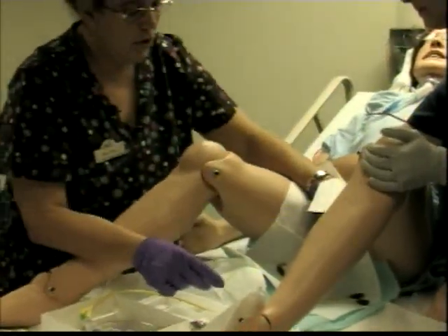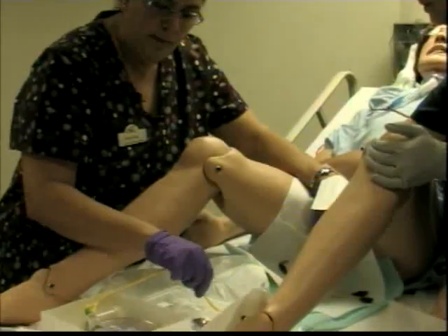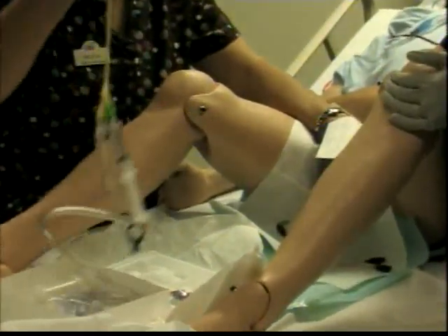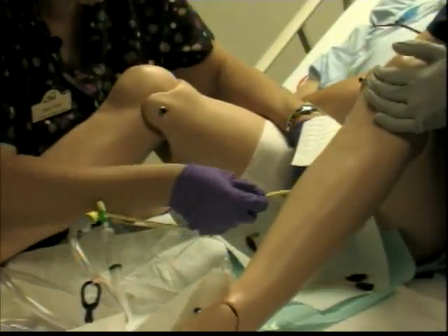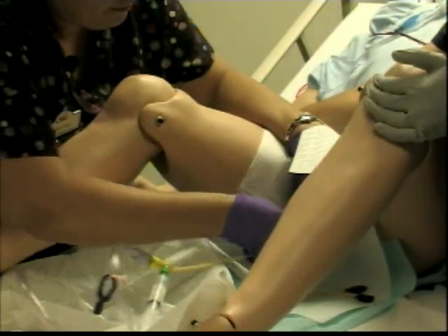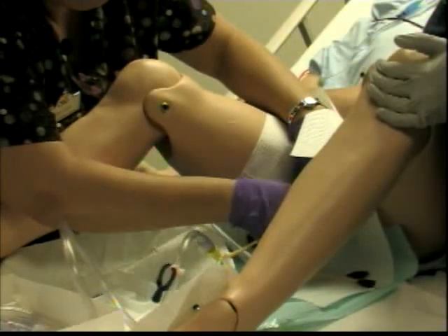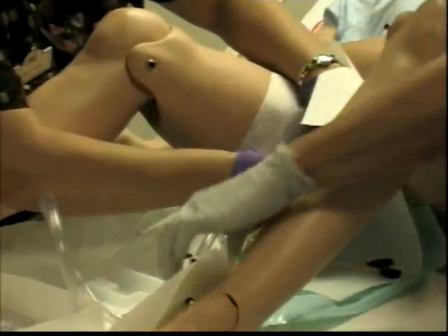Now getting ready to insert. Make sure that you lubricate very well. You're going to tell your patient: "Ms. Shapiro, I'm getting ready — please bear down for me." When she does, I'm going to introduce the catheter until I see urine coming out. And you see it — you see the urine in the catheter coming through.